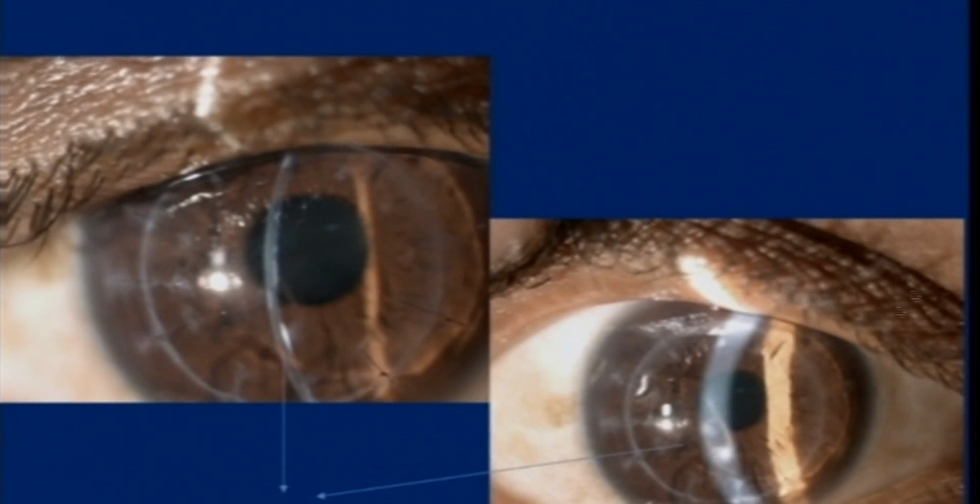So this is how they appeared after surgery. This is the 6 months follow-up of the first case. You can see a scar here, but it has sealed very well. The second case, which had a paracentral scar, and the patient did very well optically.